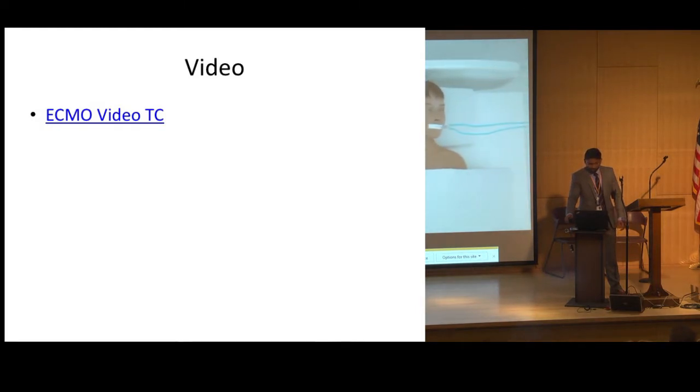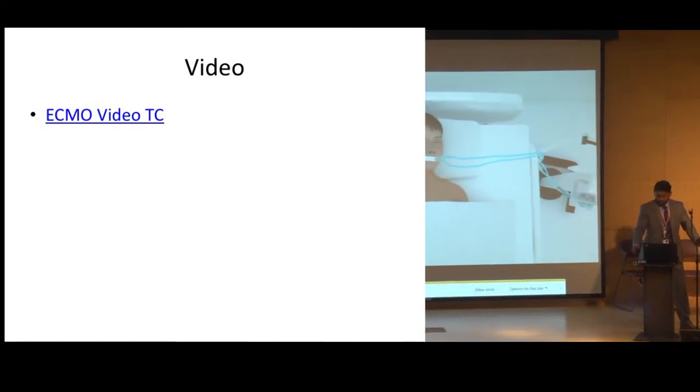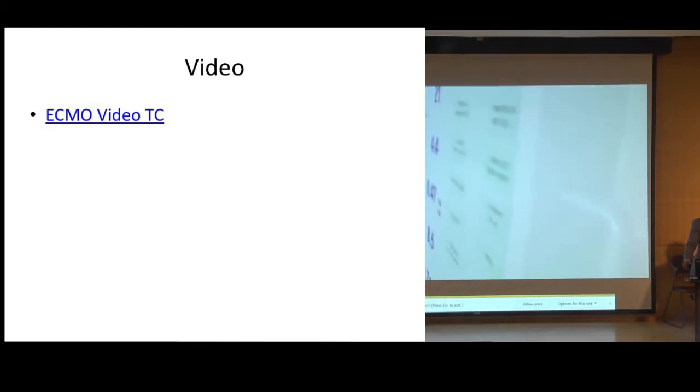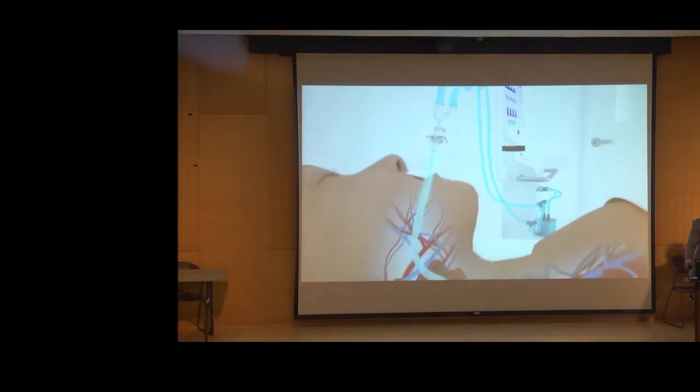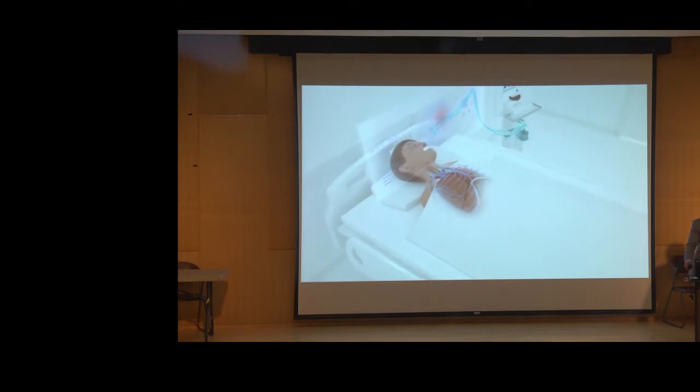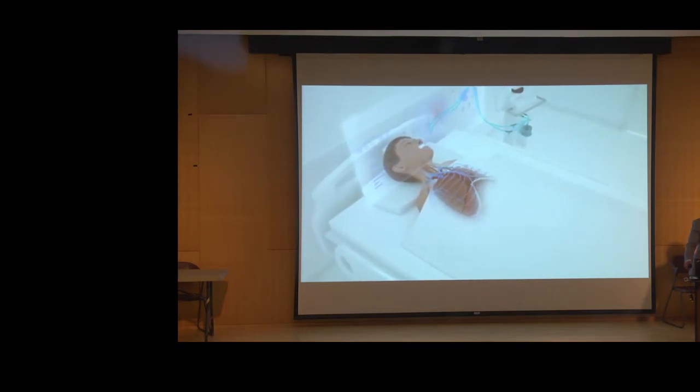Saving a life is no easy task. Options for treatment vary based on the severity of injury, the prior health of the patient, the experience of the medical team, and the resources available within the hospital. For over 60 years, doctors relied on ventilators to supply oxygen and remove carbon dioxide when a patient's lungs or respiratory system fail. Ventilators oxygenate the body by forcing air into the lungs through a tube inserted into the trachea. As the ventilator pumps air into the body, the lungs inflate to mimic the process of breathing.